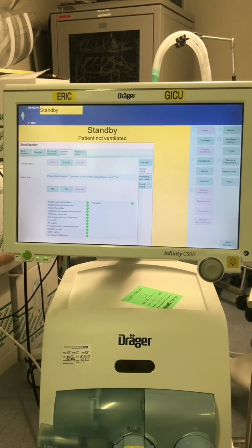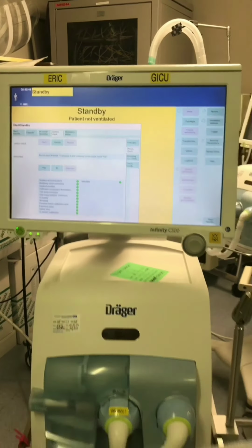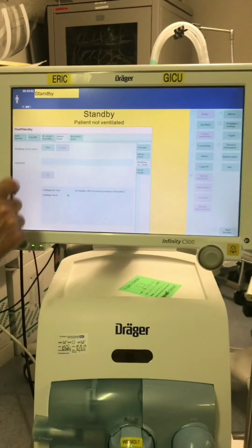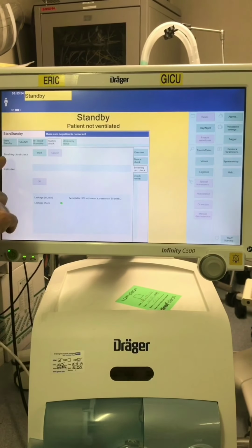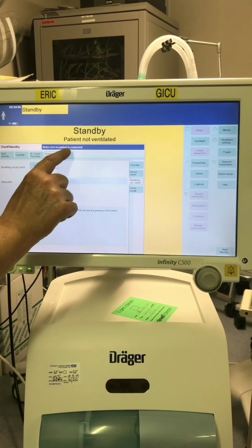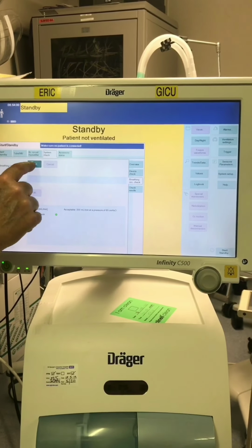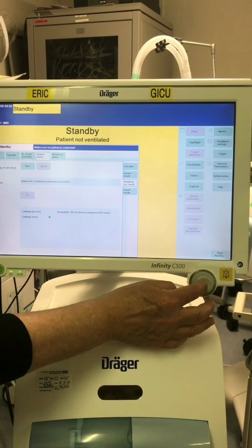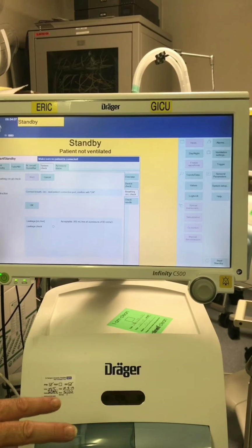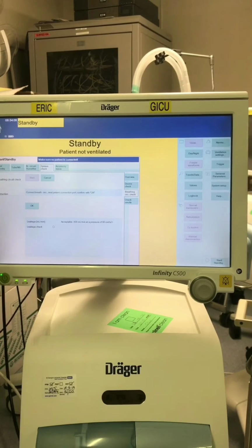I recommend that we do this because it's actually checking the circuit that has been put onto the ventilator. So we say yes, and then it says breathing circuit check, start. There's also a proviso here to say make sure no patient is connected. So I'm going to press start, confirm. This breathing circuit check is checking for the leakage and compliance and resistance.